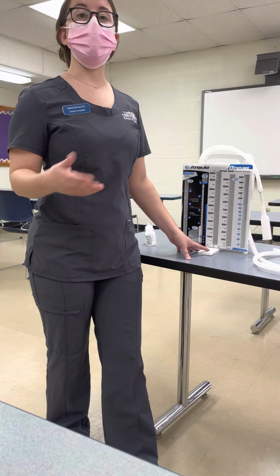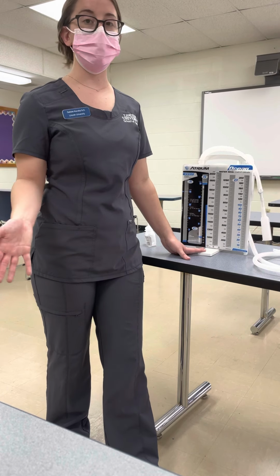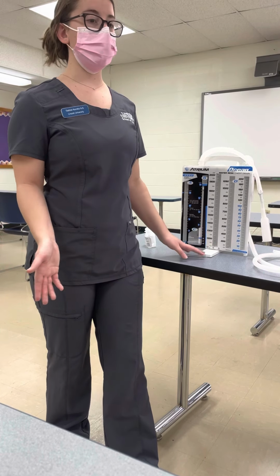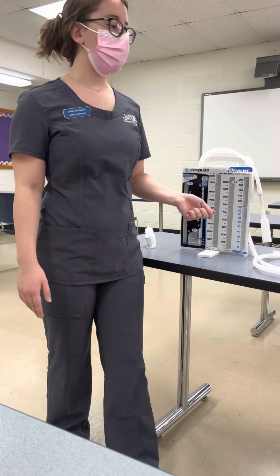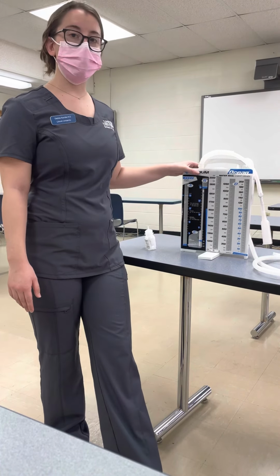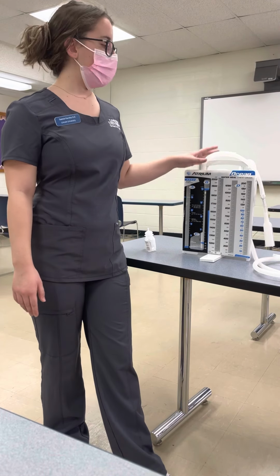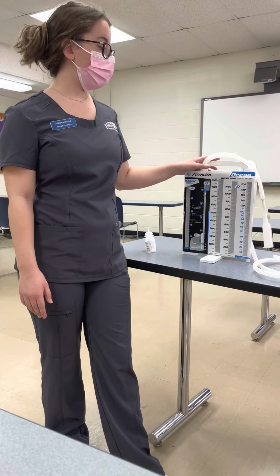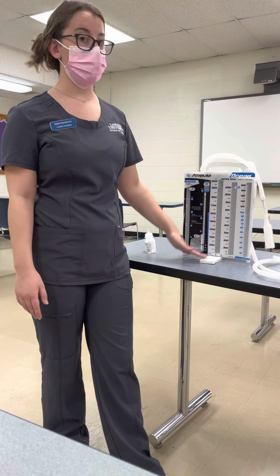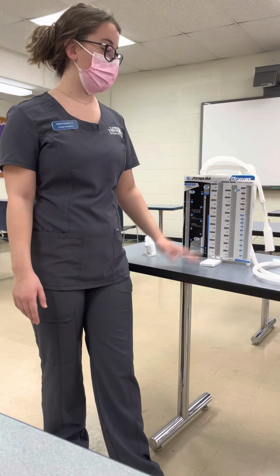So when we do that, they can do it at the bedside, and if they need medications for pain, they can do that. But again, they're awake, it's done at the bedside, the provider will discontinue it. And once he does discontinue it, we want to make sure that we place this entire system into a red biohazard bag and place it in our dirty utility room. Again, not emptying any of the chambers, they're just going to stay that way, and we dispose of it like that. And that's all.